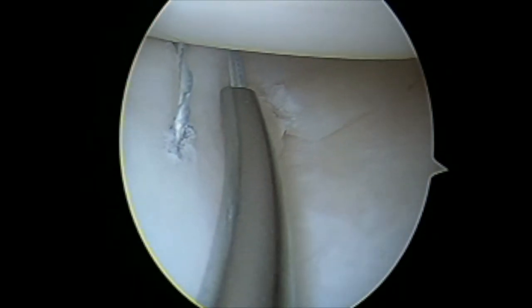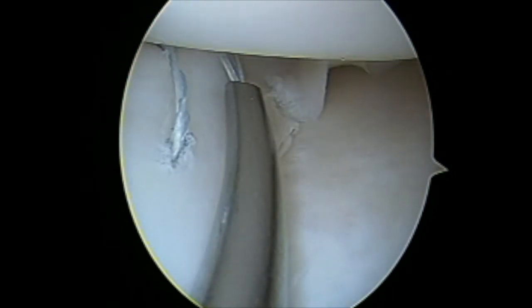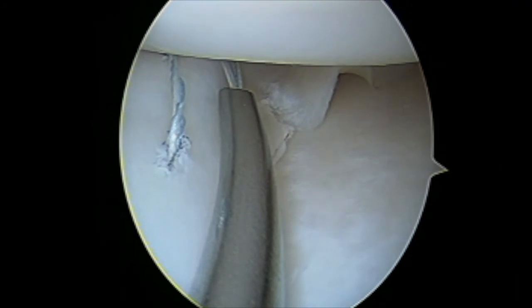Here I am using another angled zone specific cannula, firing needles through the meniscus and the capsule, which reduces the meniscus into anatomic position.